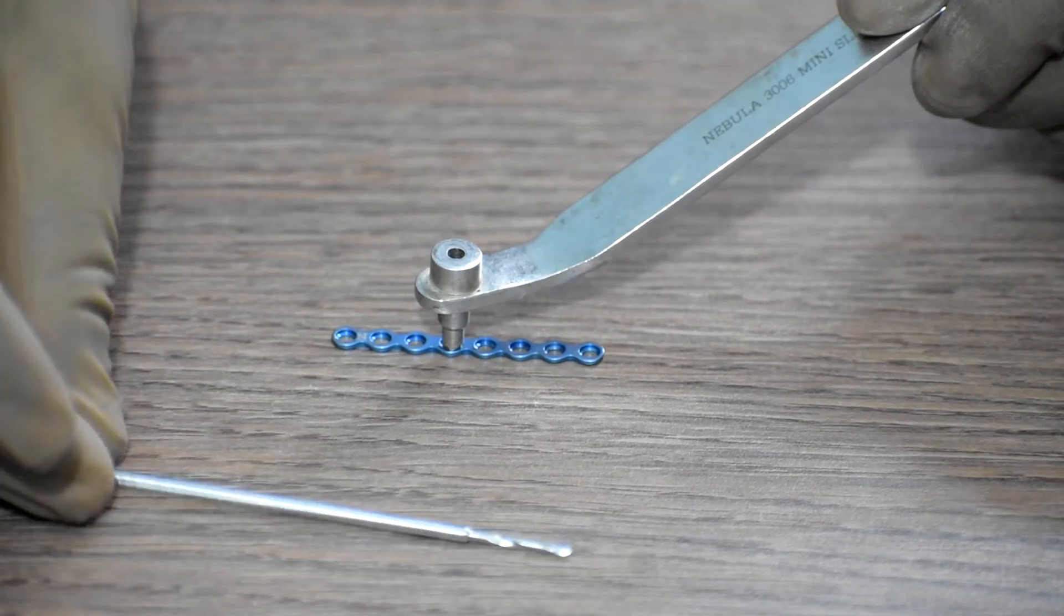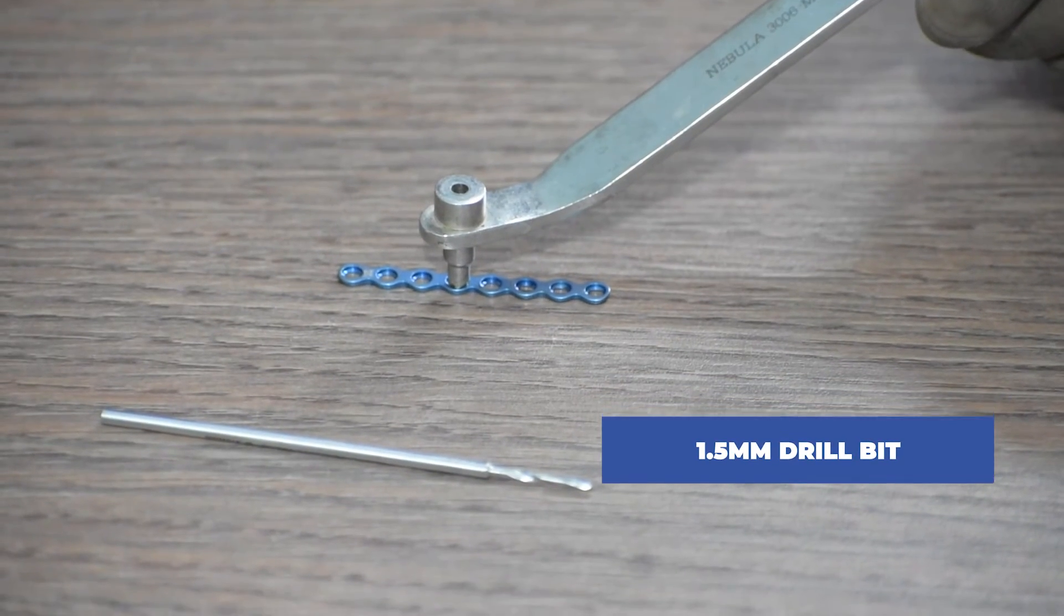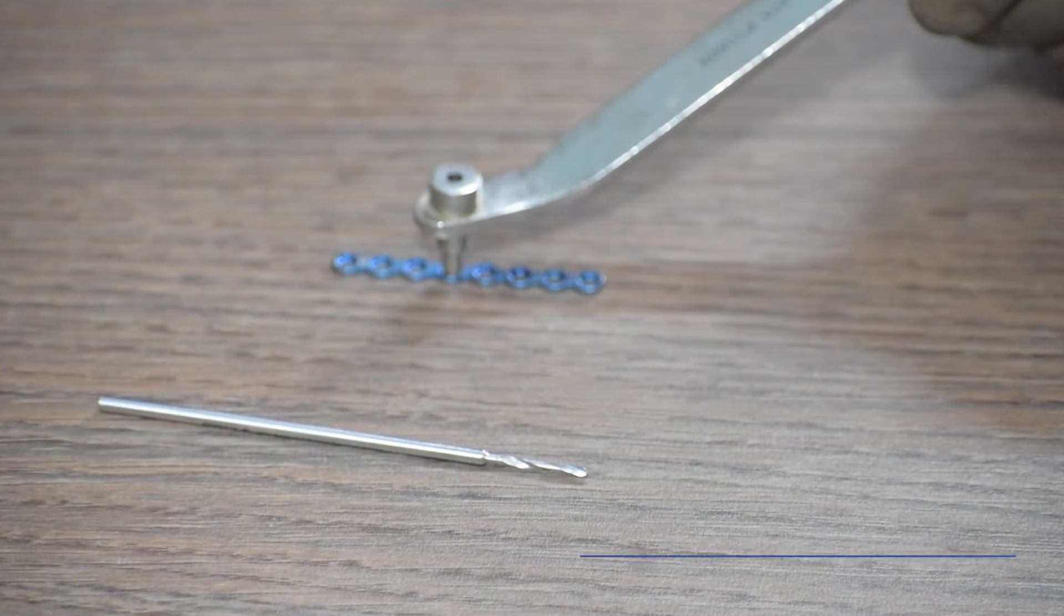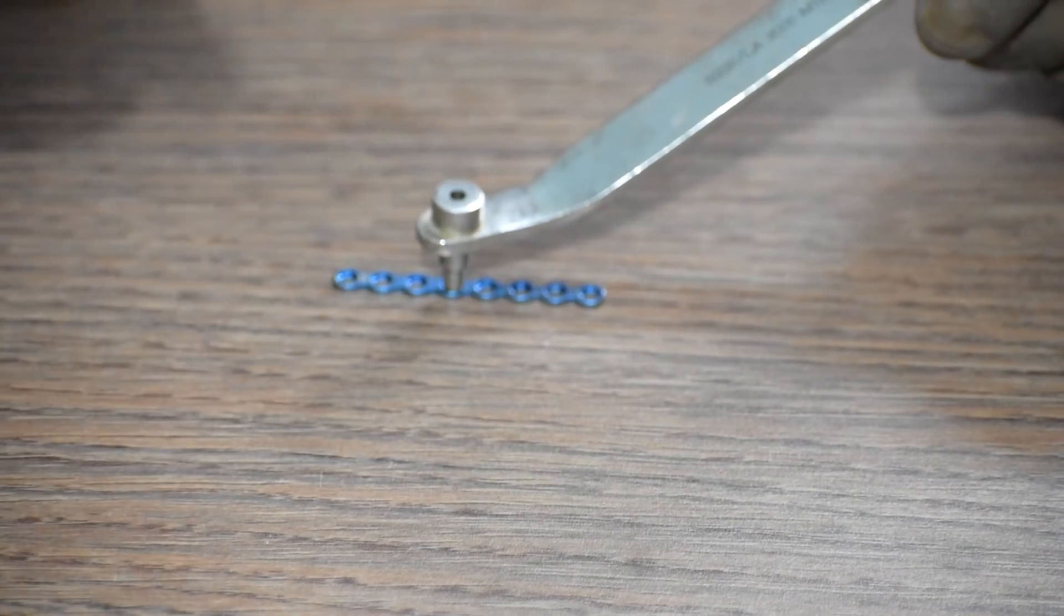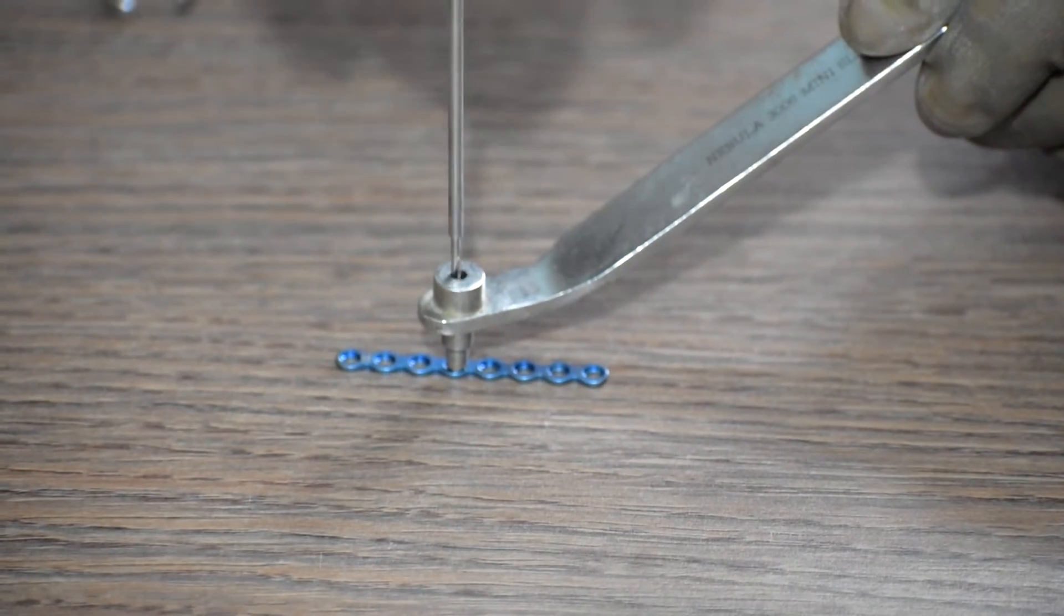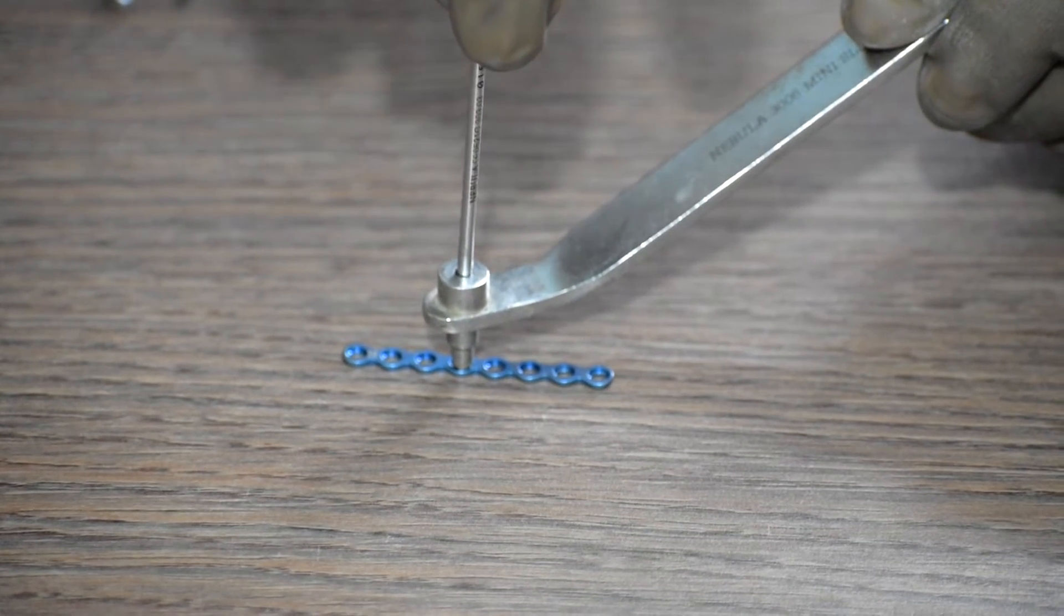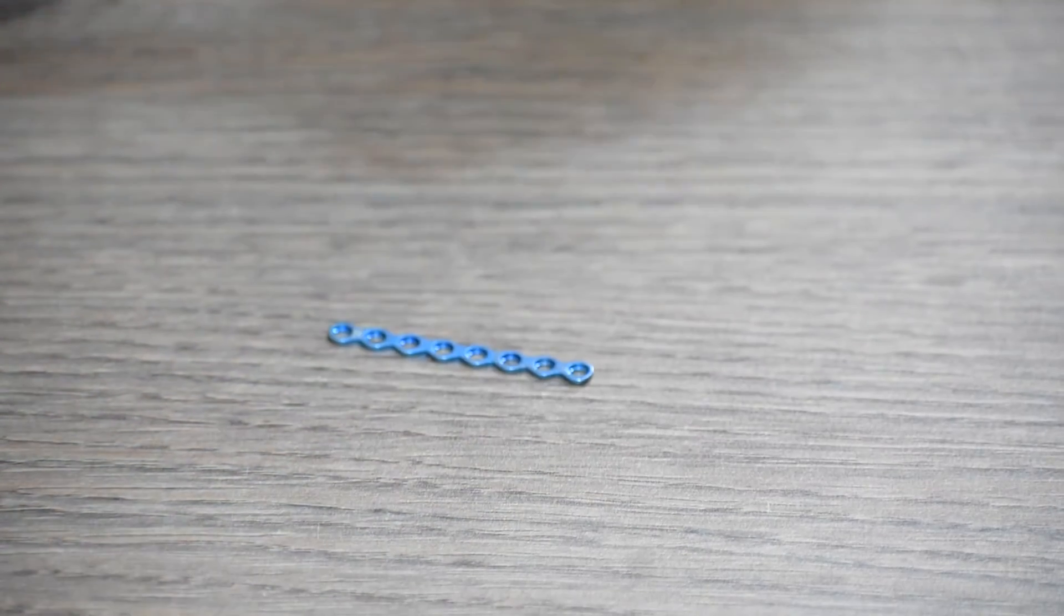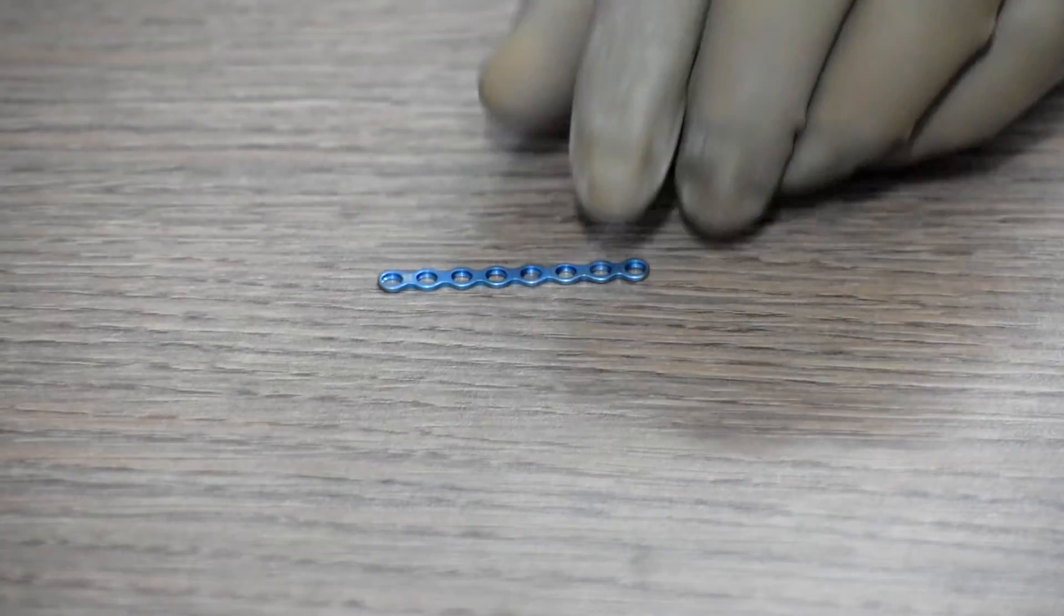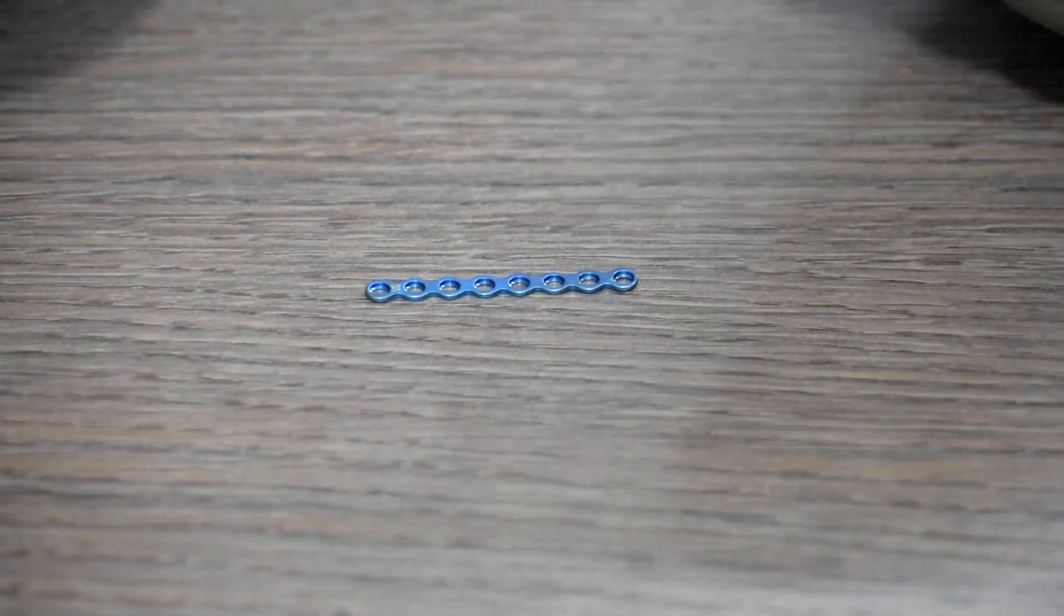Then we take a 1.5mm drill bit and drill through the mini sleeve. Once we remove the mini sleeve and the drill bit, we will have to take the measurement of the length of the screw required to be fixed.